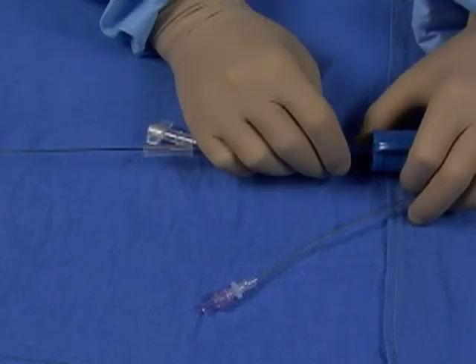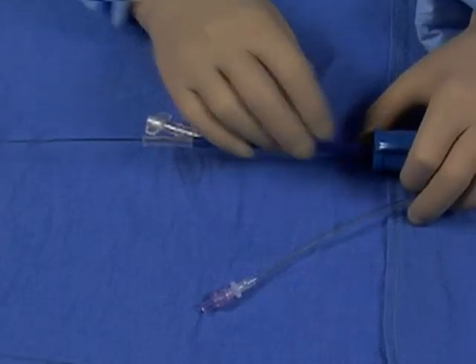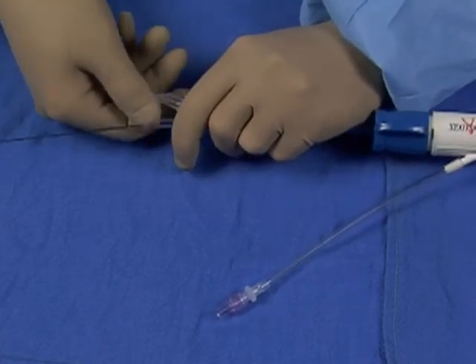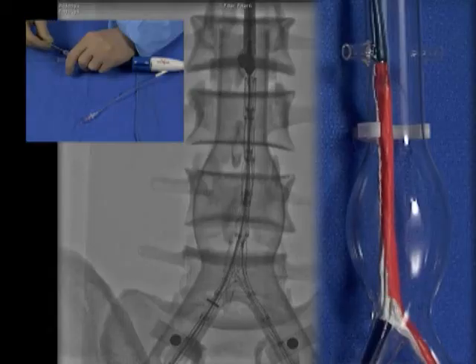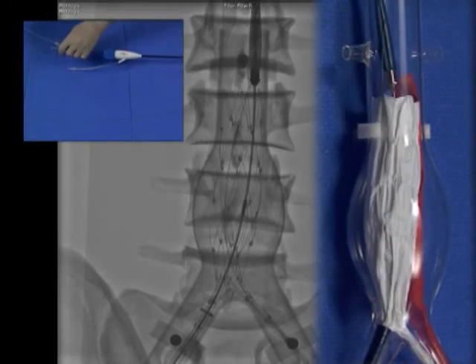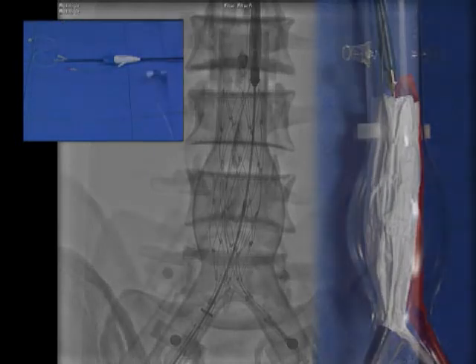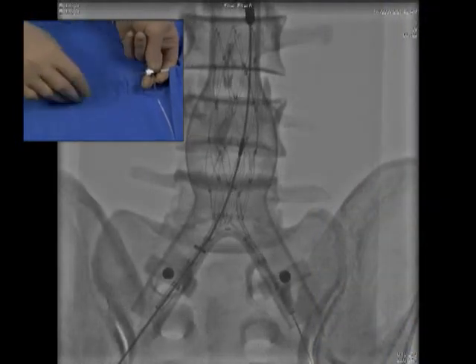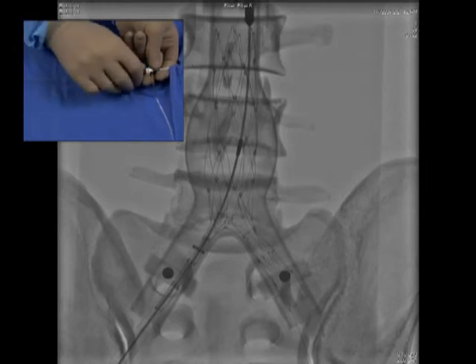To deploy the main body, stabilize the inner core assembly with one hand, then, with the other hand, twist the control cord handle until it breaks. Gently retract the control cord to deploy the main body of the stent graft. Next, pull and remove the SurePass wire until the contralateral limb is fully deployed while maintaining 014 wire position.